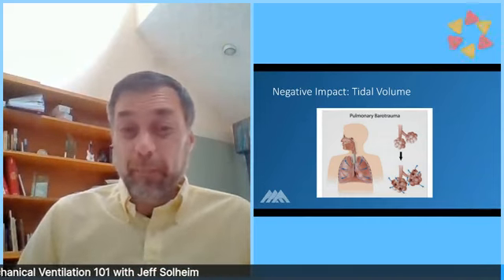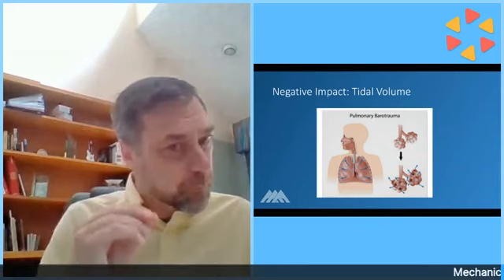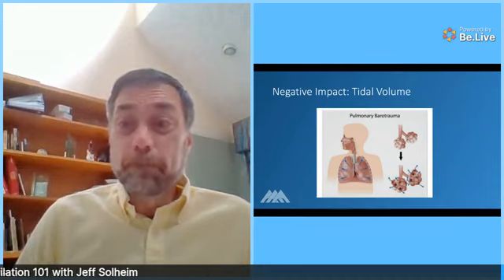Again, that seems easy, but there's problems with tidal volumes, and they should be obvious, especially when you're caring for the COVID patient. So this is where I'm going to go into COVID a little bit. But can you think about it? What is the problem with tidal volumes, right? So the problem with the tidal volume is that the lungs, the alveoli, can only stretch so far.